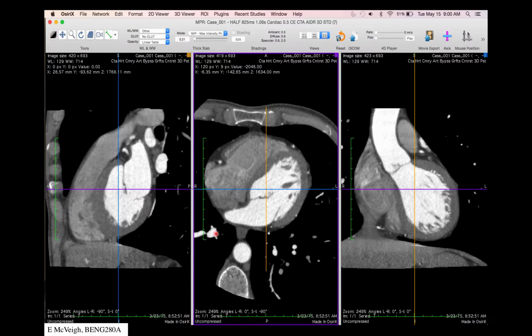Here's an example of a CT volume of the human heart, and again it has contrast in it. This is the left ventricle, with the left ventricular blood here, the right ventricle over here, the coronary arteries, one is here, one is here, the left atrium, and the aorta, this is the descending aorta. With a 3D image analysis program, in this case one called Osirix or Horos, which is free, you can load that volume data in and probe that data from multiple directions. It's essentially isotropic 3D data, so you can look at any given slice through the patient retrospectively.